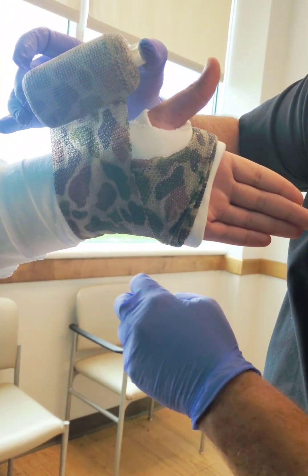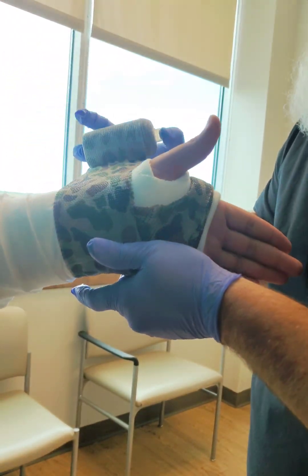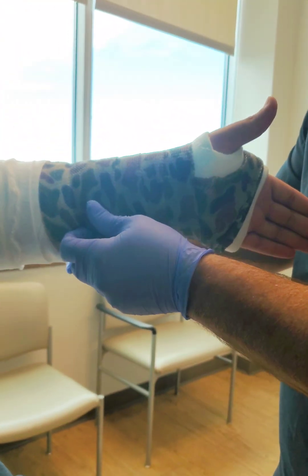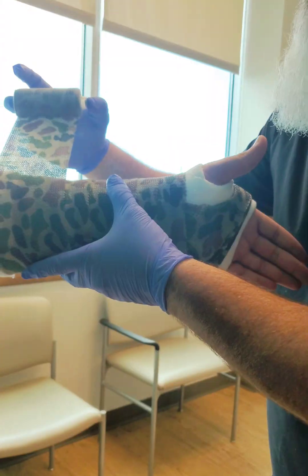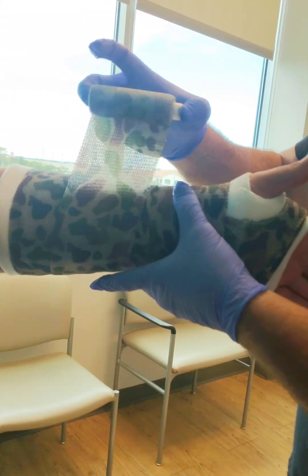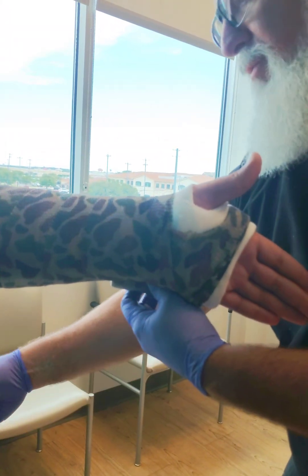As you start to come to the wrist, check for wrinkles and make sure the hand is dropped down in that position we started with. Why would the doctor order a cast in this position? The most common reasons a provider would order a cast in this position are: A, post-reduction; B, a few different types of fractures — for example, if you had a fracture involving the styloid head, the tip of the styloid, where we're really trying to focus on not only the healing of the bone but also the alignment. With a little deviation in the cast, the hope is that you will diminish the chances of surgery by doing a really well-done cast.